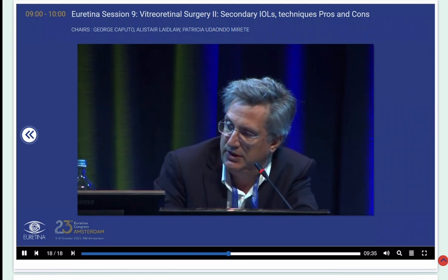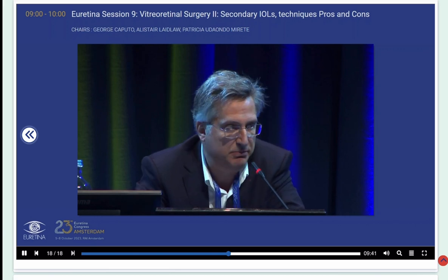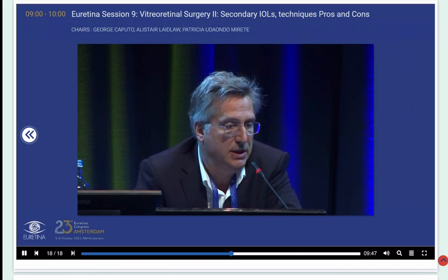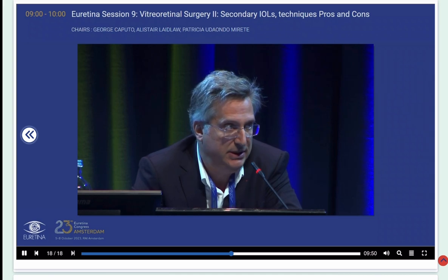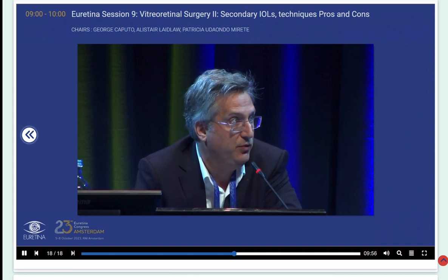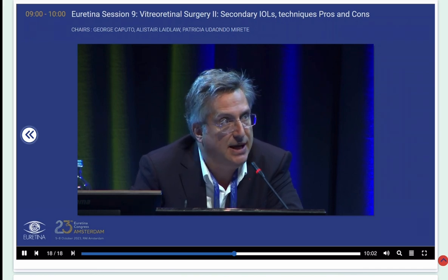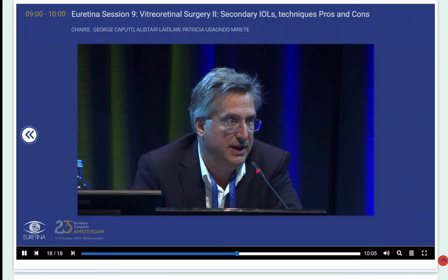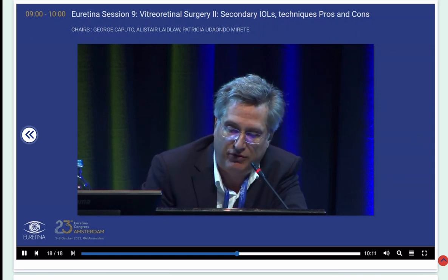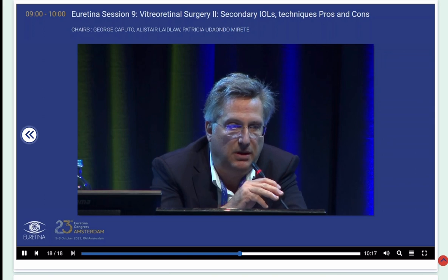There was a question that was addressed to me about iris claw in young patients. It's true that we do not recommend using iris claw in children, never anteriorly, extremely rarely posteriorly, because of the risk of trauma and dislocation. We've followed even many eyes with iris sutured IOL, and in almost all cases they end up subluxating after a few years. Any minimum age for that?